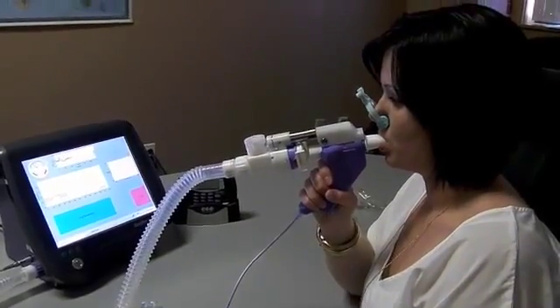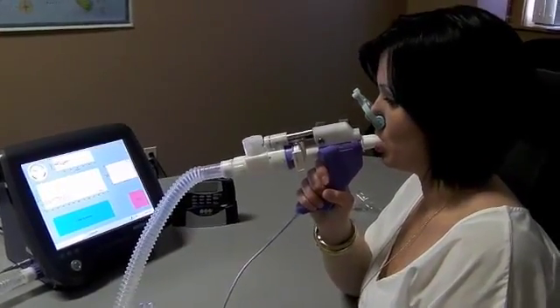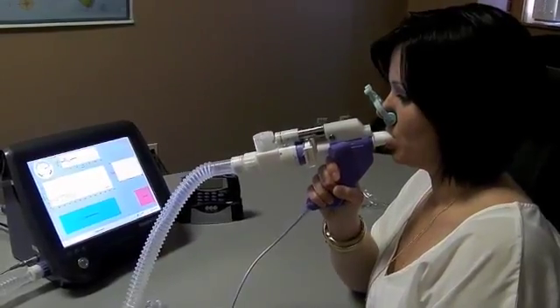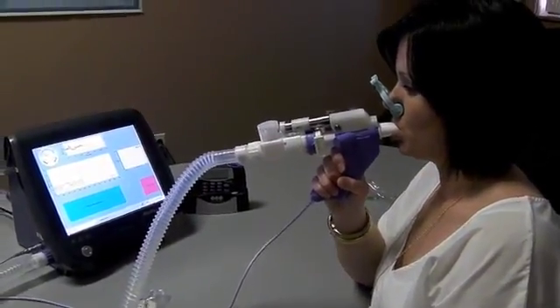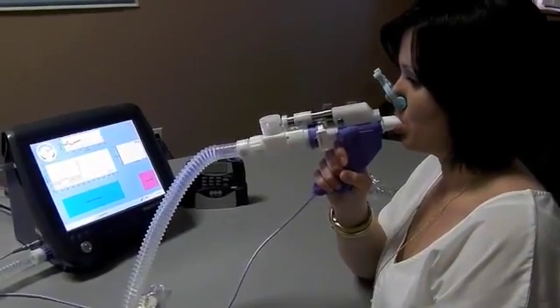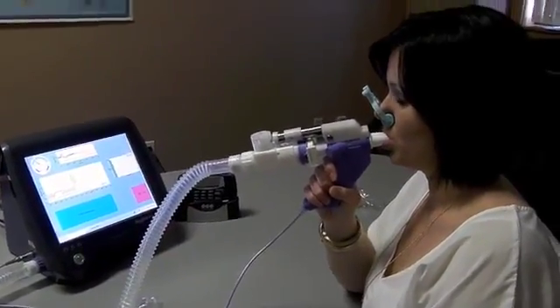So all you do through the whole entire test is just tidal breathing once the valve closes. Now the valve is closed, she's inhaling oxygen and washing out the nitrogen.